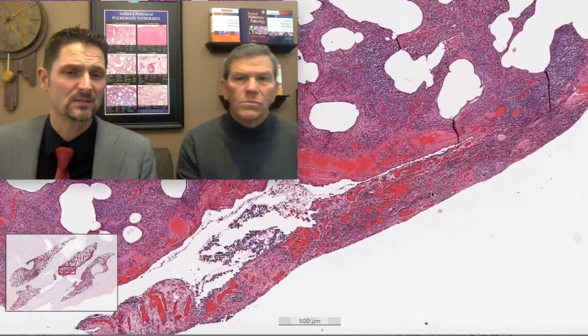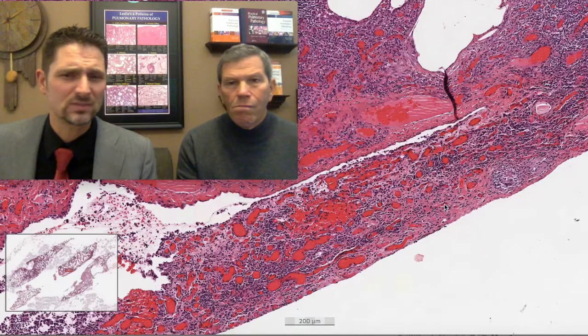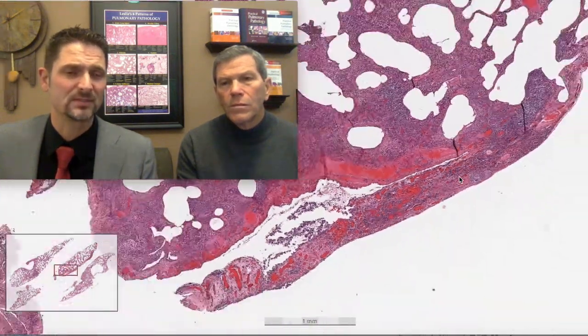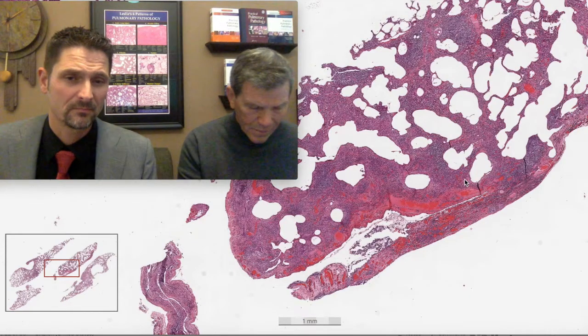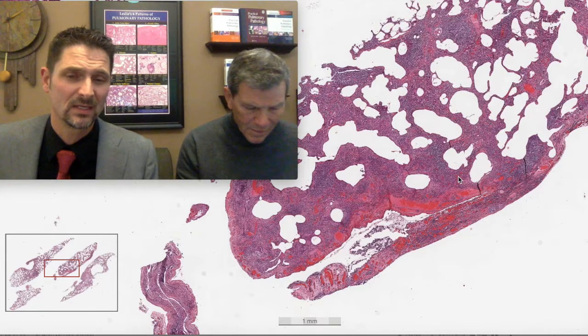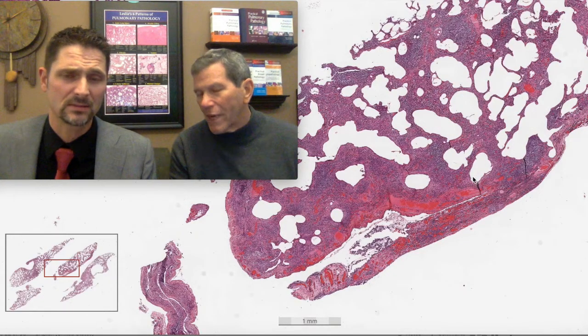To me, in this case, the outside diagnosis was hypersensitivity pneumonitis. You typically don't see this degree of pleuritis or really any chronic pleuritis in the setting of hypersensitivity pneumonitis. And so I think it's probably not hypersensitivity pneumonitis. So we've got a young lady with a dense cellular NSIP with bilateral cystic lung disease on imaging studies, and you've diagnosed it as HP. And the clinician says, wait a minute, this doesn't make any sense.